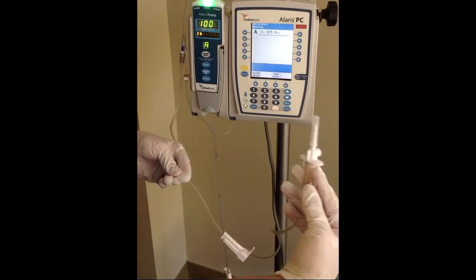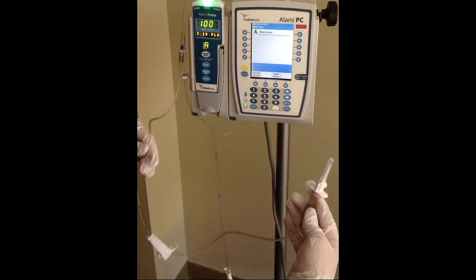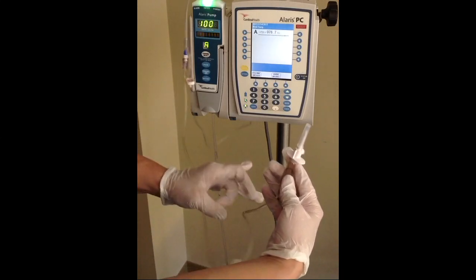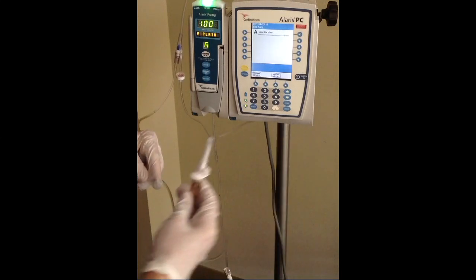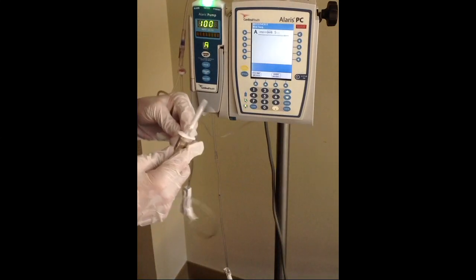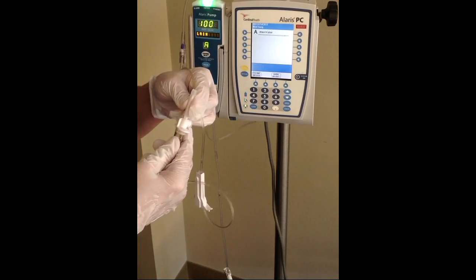Once you've got all the air bubbles out of there and your chamber's 2/3 full, you're just going to use a little technique: you can pinch the tubing with your finger and clamp that tubing once all the air is out. And then before starting to spike the bag and start programming, you're just going to pause the pump.